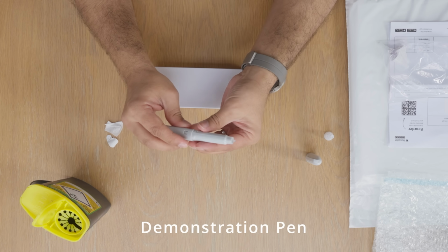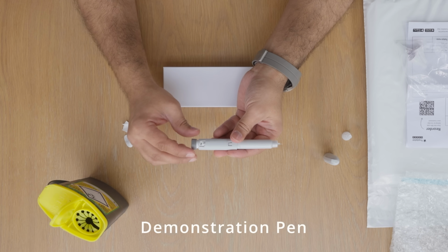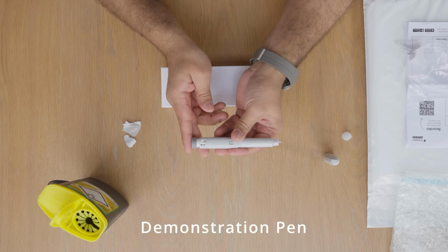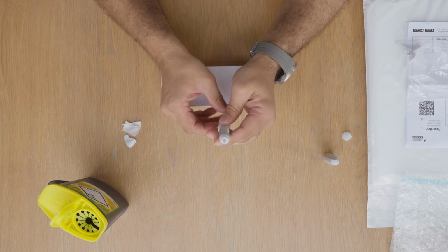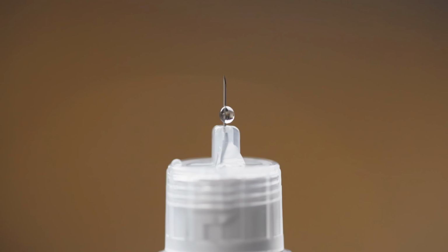This demo pen does not contain any liquid, however your pen will require to be primed before each and every dose. To do so, twist the pen until the first long line appears in the treatment window, and then press. Repeat this process until you see a small droplet of liquid appearing at the tip of the needle.